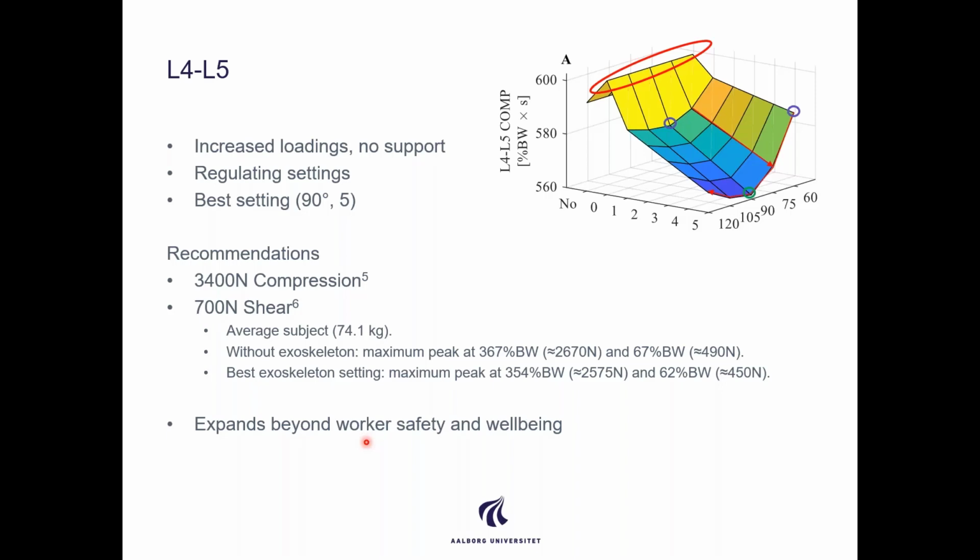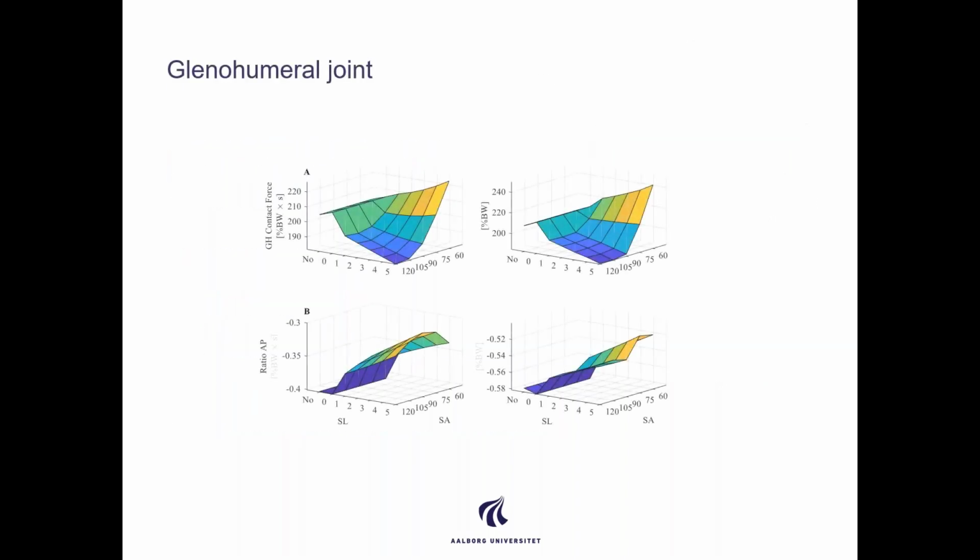And if that's the case, we might actually end up in a case where he's working more in a working day, but the cumulative load over a day is the same, because the beneficial effect might cancel out, because we will be completing too many tasks. So we need to be aware of the fact that we are not just increasing the amount of work and still remaining equal in terms of load over a working day. And this is a general issue with exoskeletons and increasing productivity.